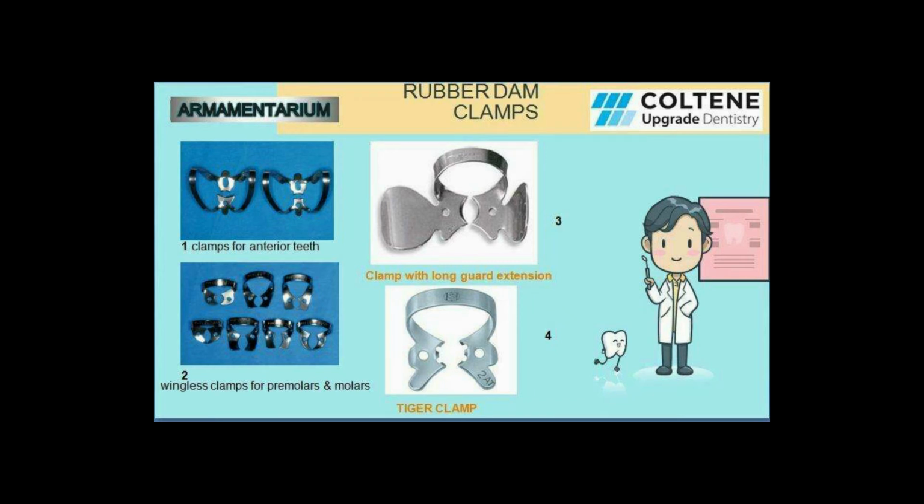Now, continuing with the rubber dam clamps, next we will talk about the wingless clamps. The blue color pictures, both upper and lower, are the wingless clamps. The upper one are for the anterior teeth and the lower one are for the premolars and molars.